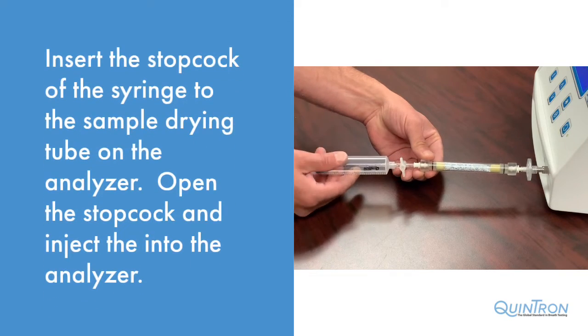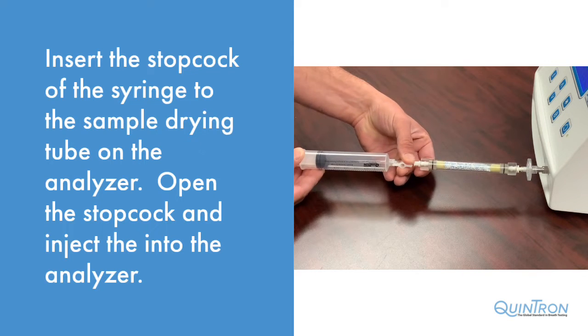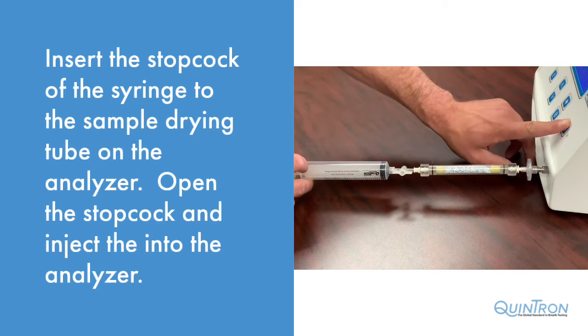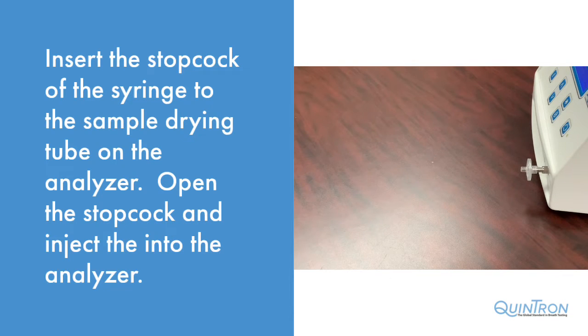With the analyzer in the run-ready mode, insert the patient sample into the drying tube. Open the stopcock, inject your sample, and press the start button on the analyzer. When the display reads run-wait, you can remove the sample from the front.